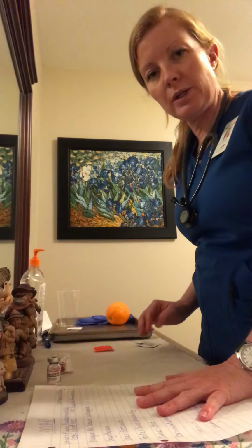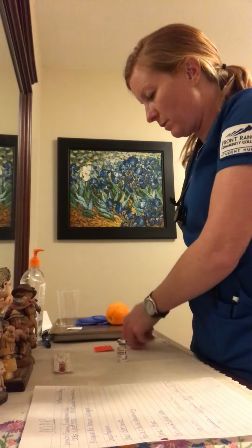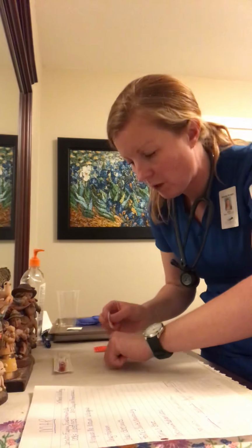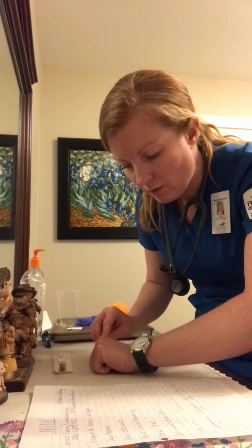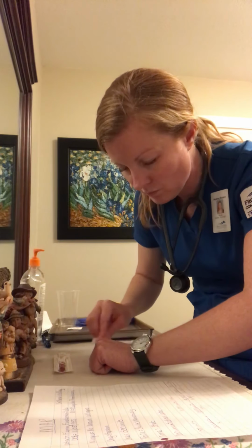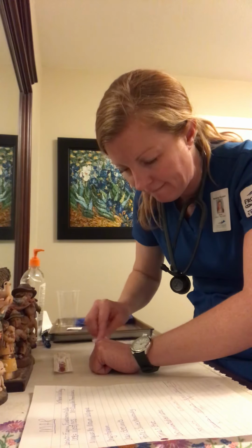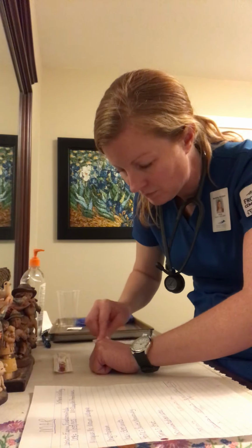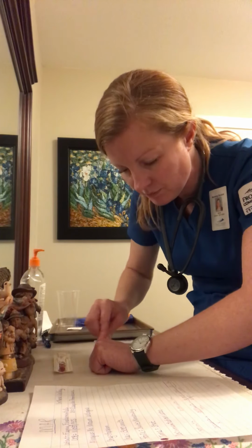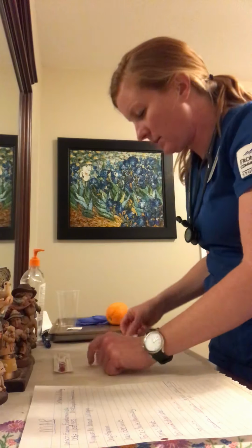So next we are going to be cleansing the top of the vial vigorously with an alcohol wipe for 15 seconds using our watch. So beginning now. We'll do this vigorously for 15 seconds. Okay, we've cleaned it for 15 seconds.